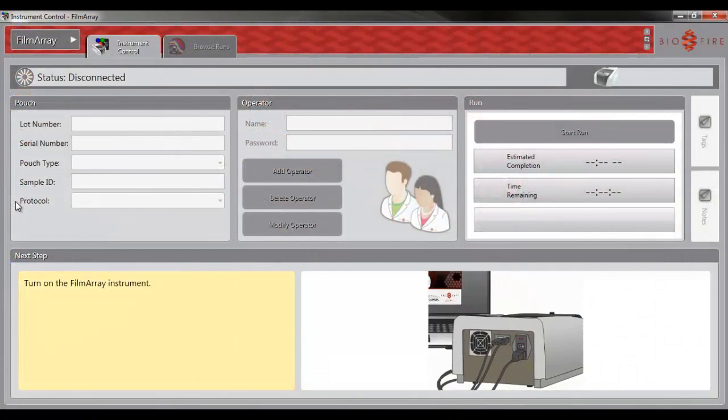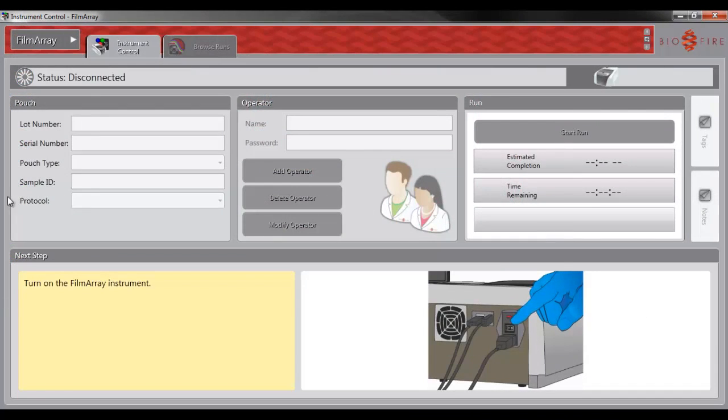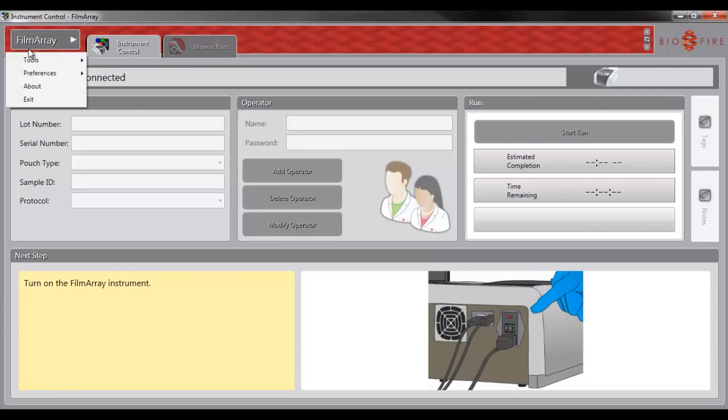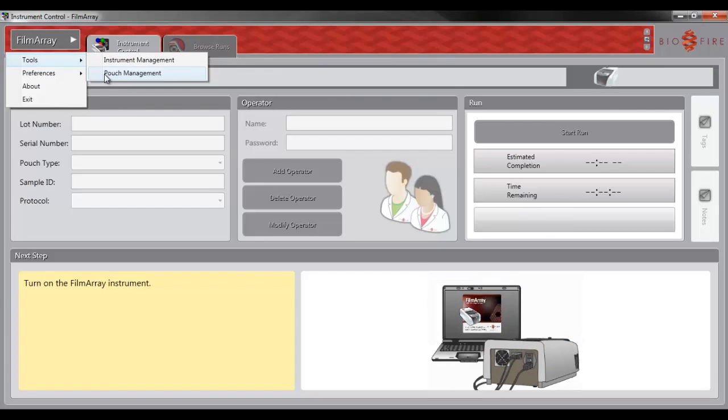Once the software is open, go to the upper left and select FilmArray, then Tools, and then Pouch Management.